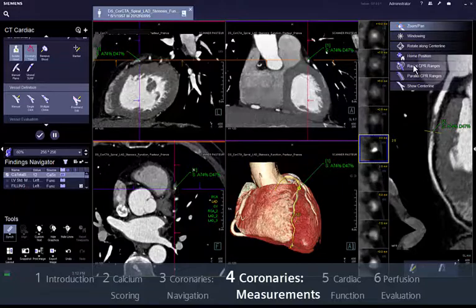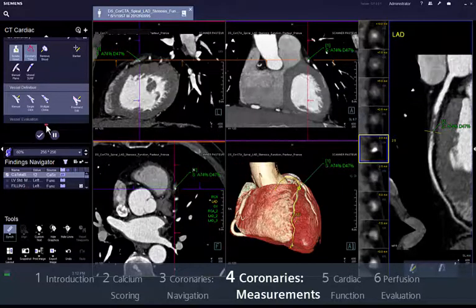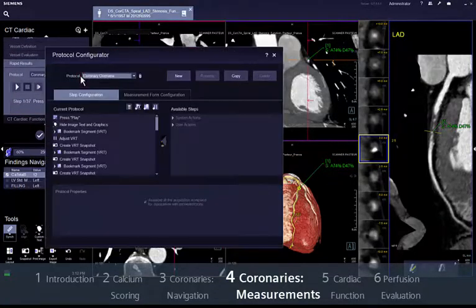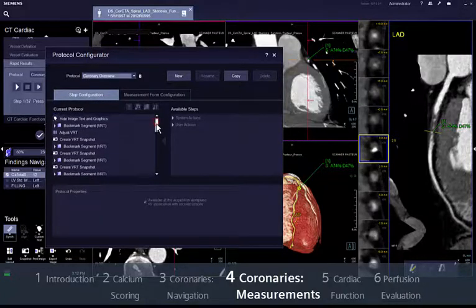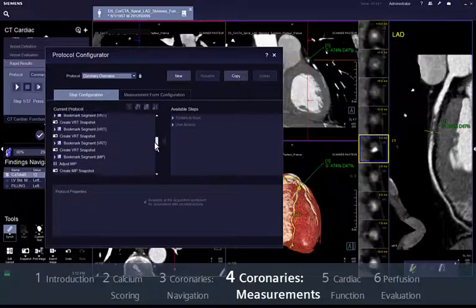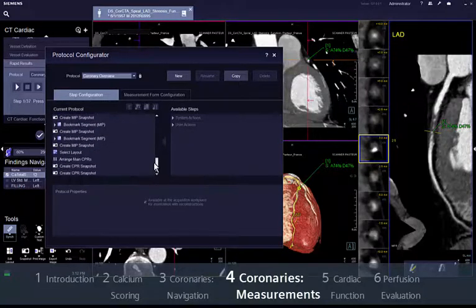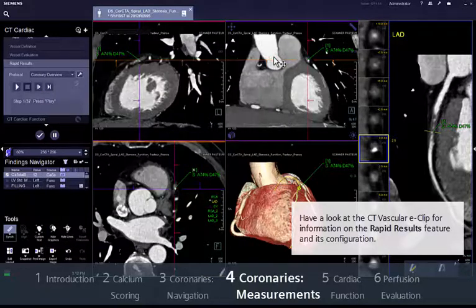For standardisation of your reporting procedure we have created the Rapid Results step. Here you have the option to not only create a standardised report but also to define default reconstructions for every patient — for example, radial CPRs for the main coronaries or the standard cardiac angulations. Have a look at the CT vascular eclip for more information on the Rapid Results feature and its configuration.